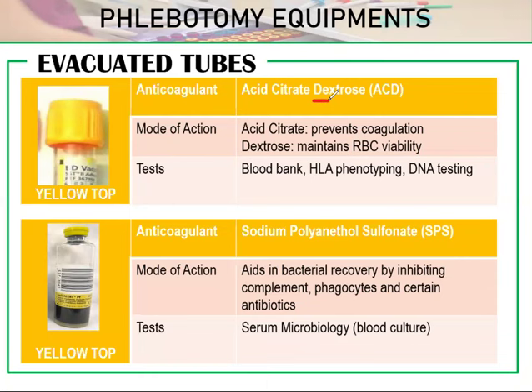It's because this is usually for special testing. So, HLA phenotyping, that is our human leukocyte antigen. This is for determining paternity evaluation, so these are DNA testings. And other than that, it's for transplant compatibility. Before organ transplantation, we check if the donor is compatible with the patient or not.